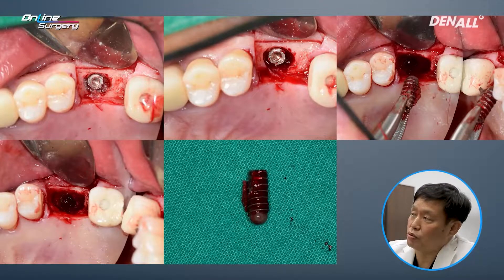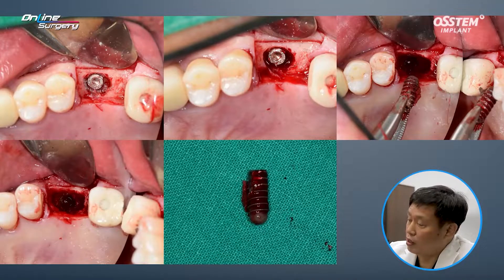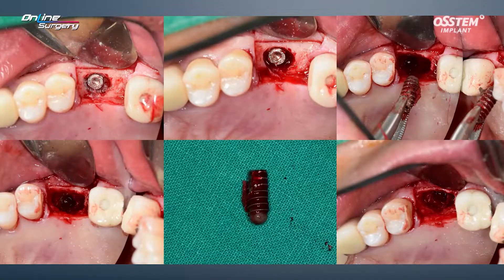I used a Fissure Burr and avoided the buccal side — mesial, distal, and palatal sides were utilized for elevation. After implant removal, you can see the hole where the implant used to be. Looking at the palatal side of the patient, there is still residual bone due to how it was originally placed. Therefore, I attempted to place the implant once again.